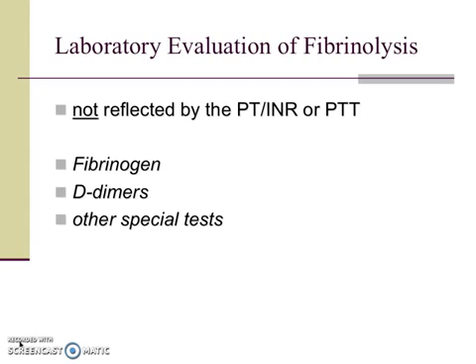The coagulation analyzer stops its internal timer as soon as the plasma in the test cuvette solidifies. Therefore, the PT-INR and PTT tests do not measure fibrinolysis pathway function at all. Laboratory tests of fibrinolysis include measuring fibrinogen and D-dimers. Hereditary disorders of fibrinolysis are extremely rare, so other specialized tests are referred to reference laboratories for testing, and these are not routinely available in the coagulation lab.